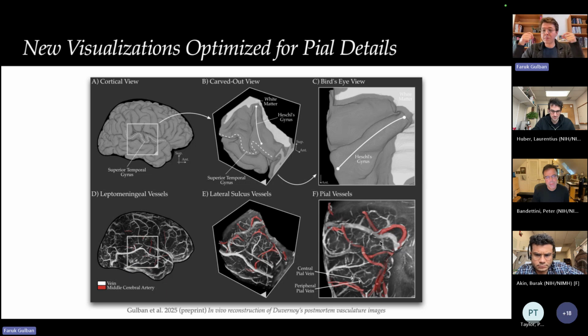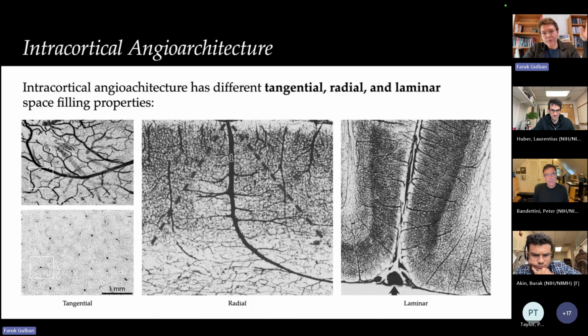But the crucial part, in my view, for judging the performance of those algorithms is having a good enough visualization way so that we can quality control the outputs. So far, I didn't encounter any algorithm that satisfied me, to be honest, to give a good enough vein segmentation. That's why we spent time on making the visualization the most convenient so that it is set for the future quality control steps. So now that's on the side.